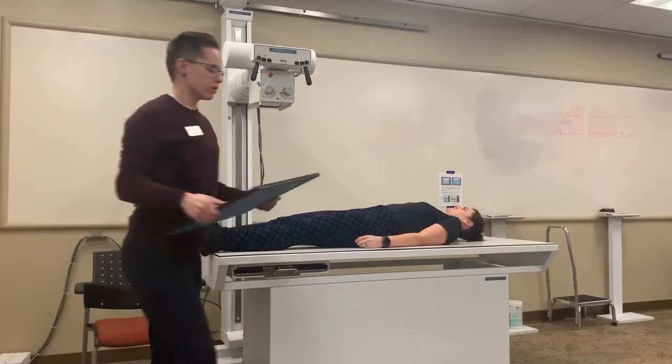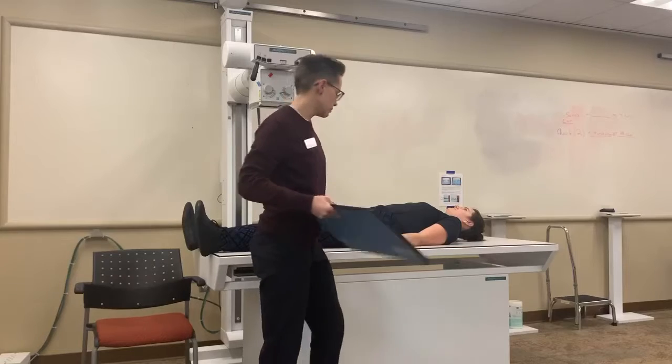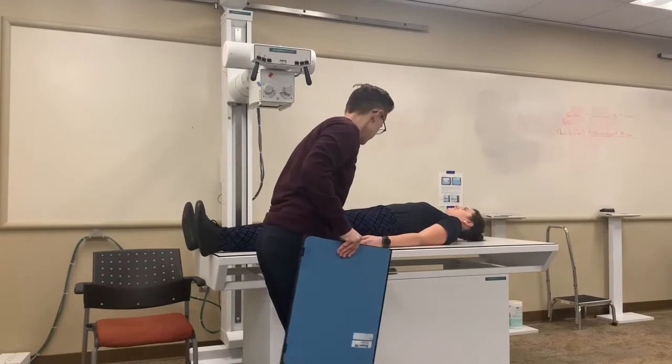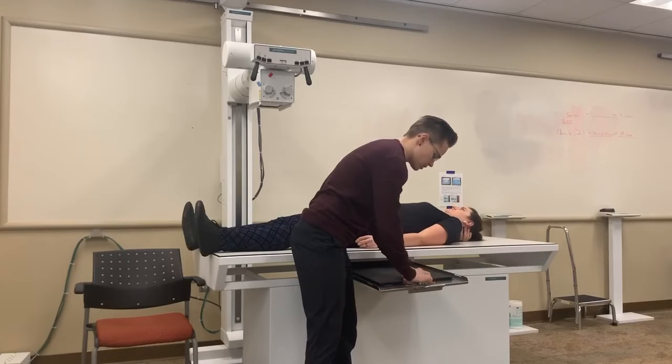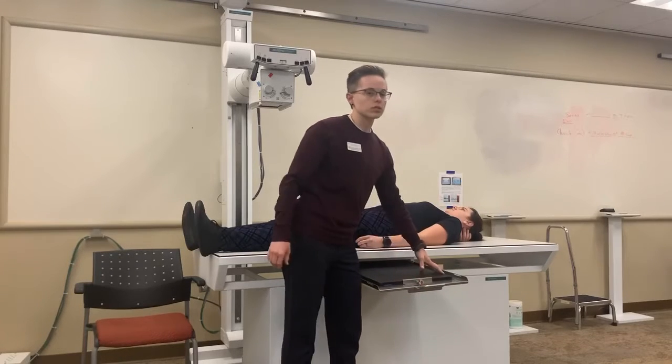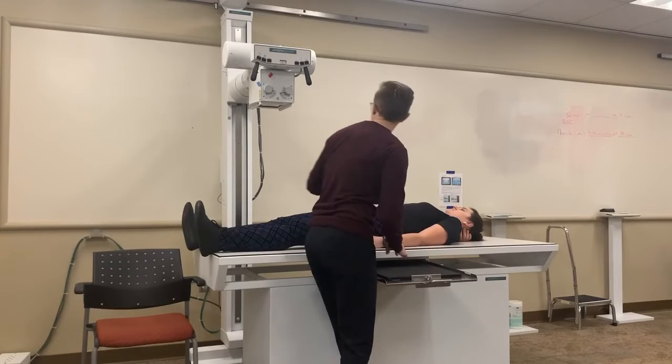So for an A to P pelvis, we're gonna take a 14x17 film crosswise and put our ID blocker up. The top of your cassette is gonna go 2 inches above the iliac crest. So we palpate 2 inches above.